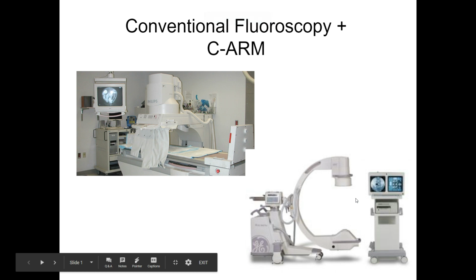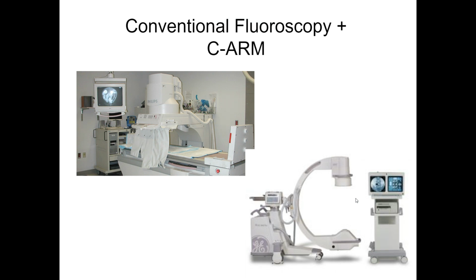Okay, so first part of fluoroscopy, we're going to talk about conventional fluoroscopy. And when I say conventional, we're still getting digital images. It's not like we're talking about spot films that you may have heard of or actual cassettes being utilized. Most of it is still digital.